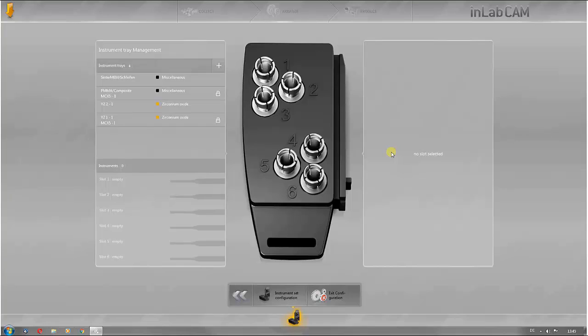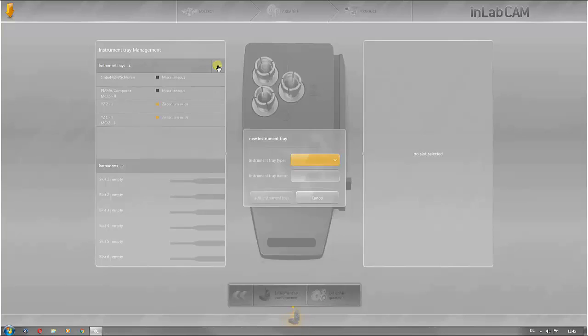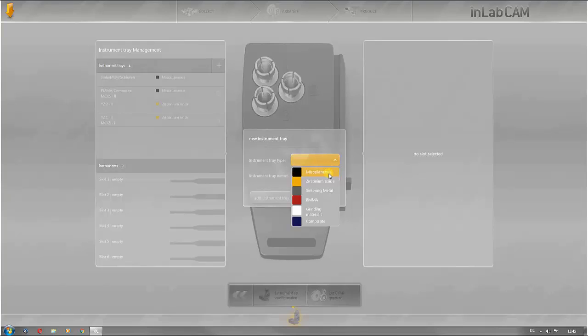These can be edited, for example by replacing burrs. The tools and trays are color-coded according to the materials. The black color index represents an instrument for miscellaneous materials, yellow for zirconium oxide.